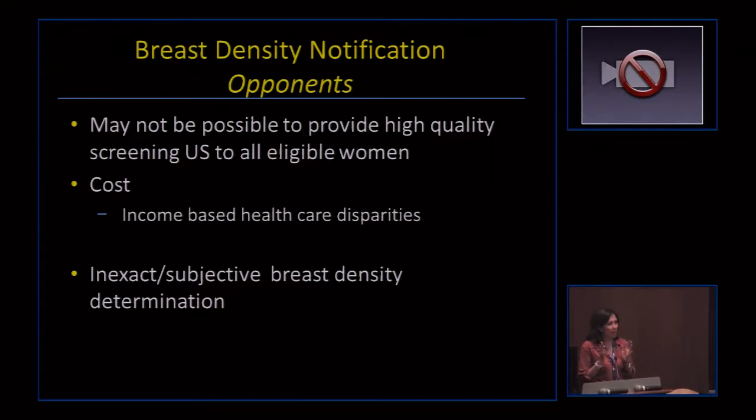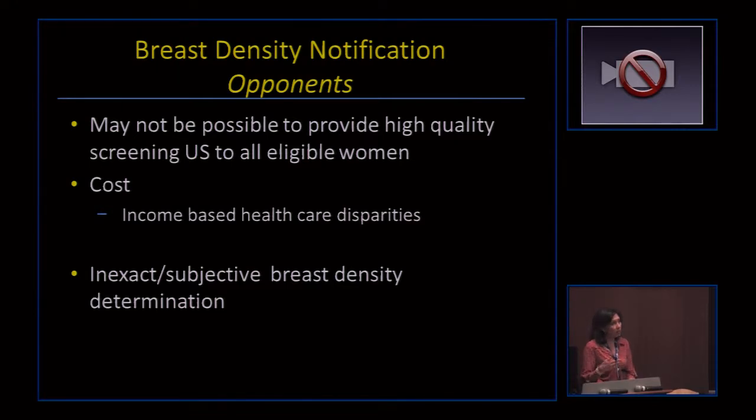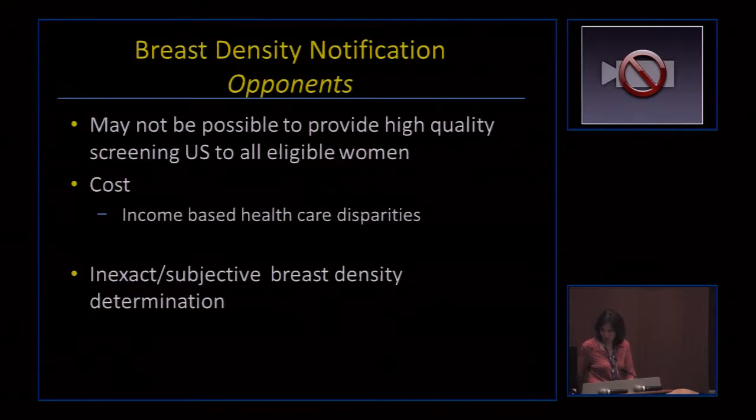So we determine breast density based on the radiologist looking at the mammogram, which a lot of times is very straightforward. But if you're right in the middle, it's really hard for us to say, like if you're 48% or 52%, and one year somebody's going to be called dense, and maybe the other year the same radiologist could call it not dense. So there's inter and intra-observer variability, which is an issue. There's some computerized modules that are being developed to more accurately determine breast density, but those are fraught with issues and they're not widely used yet.